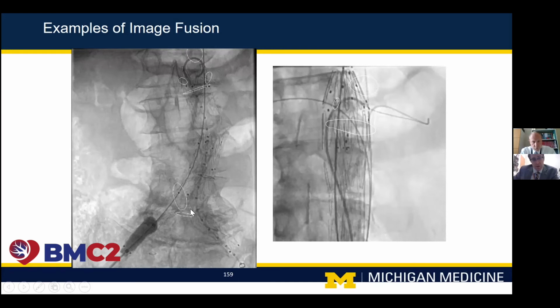That's the part I always notice: with fusion, your iliacs are going to be in a different position many times. Now, the bifurcation of the iliacs a lot of times is closer to where it is on the fusion. So if you mark your bifurcations, I think that's a little more useful. But that still can move as well with a stiff wire.